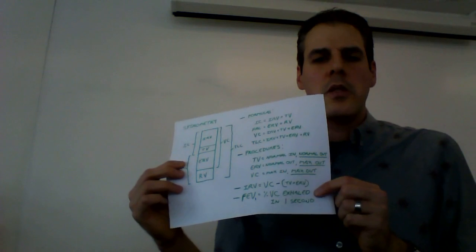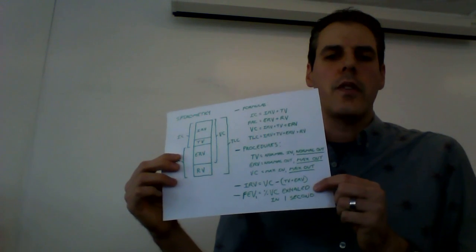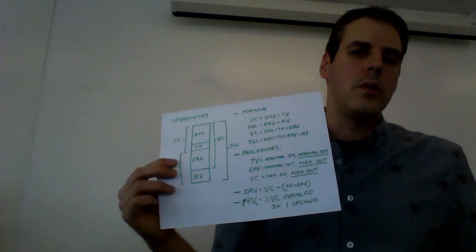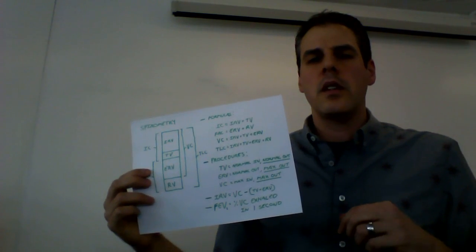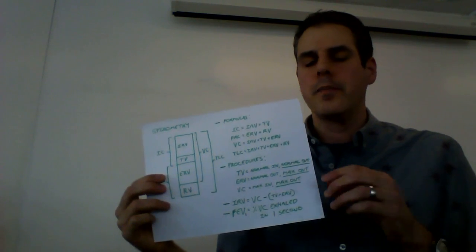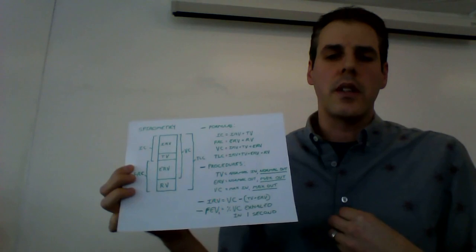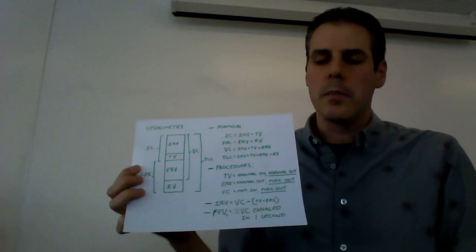So there's a measurement called the forced expiratory volume, which means what percent of your vital capacity you can exhale in, say, 1 second, FEV1, or 2 seconds, FEV2. Usually most people can exhale at least 75% of their vital capacity within 1 second. If you have asthma, say, and it's acting up, then your airway is constricted, and you might not be able to have a very high FEV1.